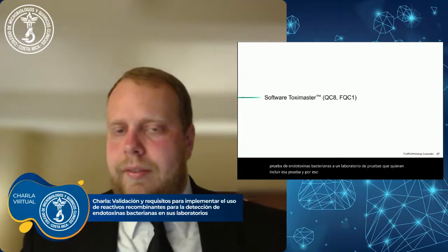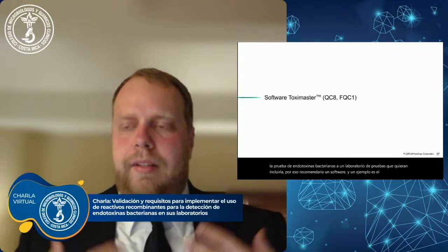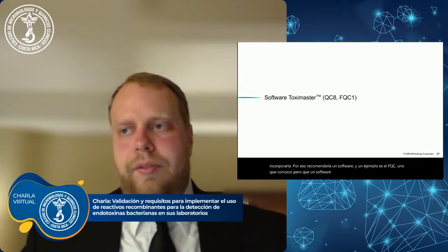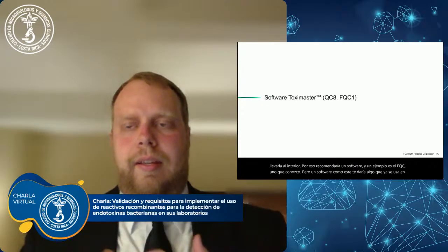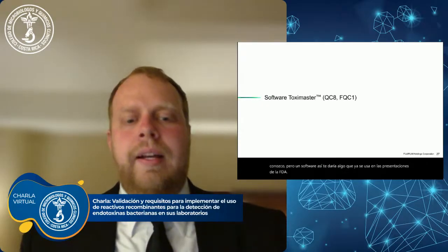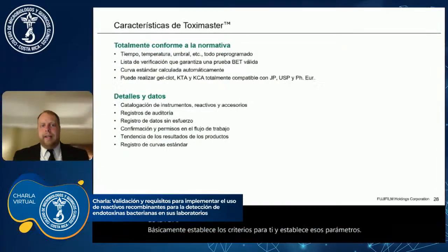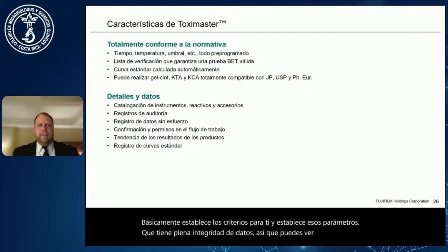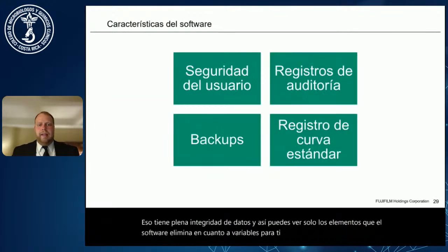An example is the FQC1 software that I'm familiar with, but a software like this would give you something that is already used in FDA submissions and essentially sets the criteria for you and sets those parameters, that has full data integrity. And so you can see just the items that software eliminates as far as variables for you in terms of wanting to bring in this reagent.